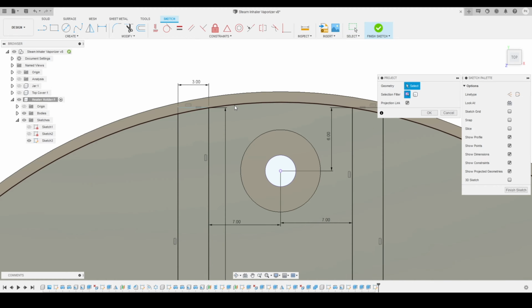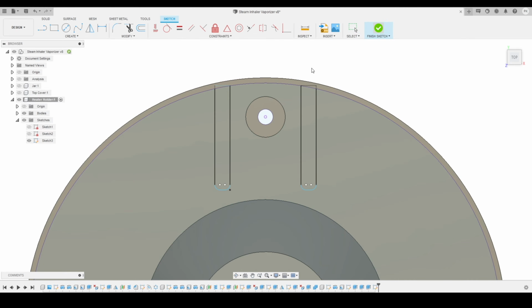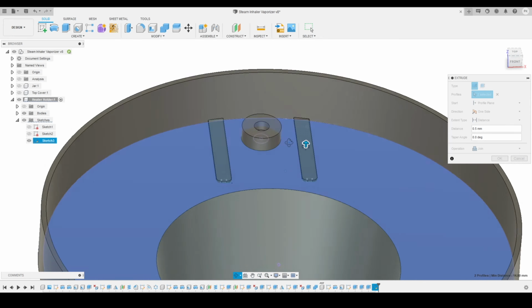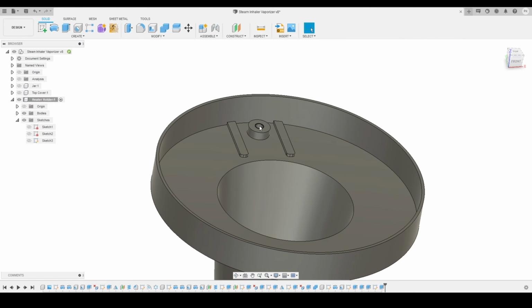We'll activate this project tool and project the outer circle of this body, and then I will select these 2 profiles and give them an extrude distance of 0.5 millimeter or 1 millimeter and press OK. So here you can see this kind of shape we had created.